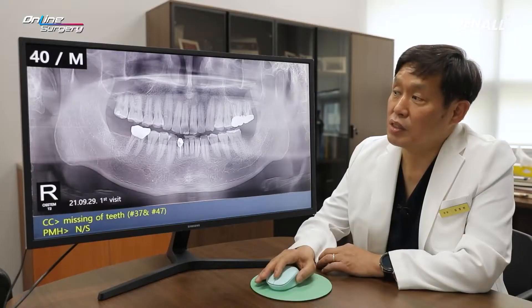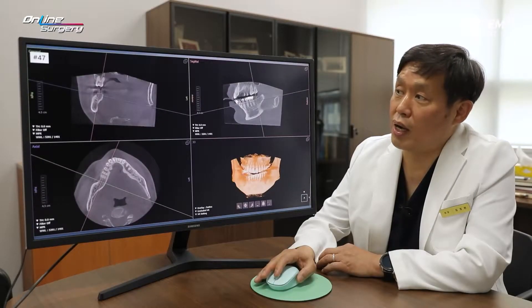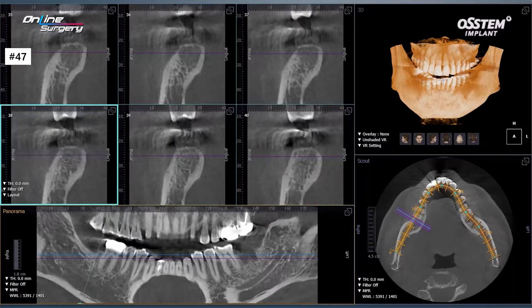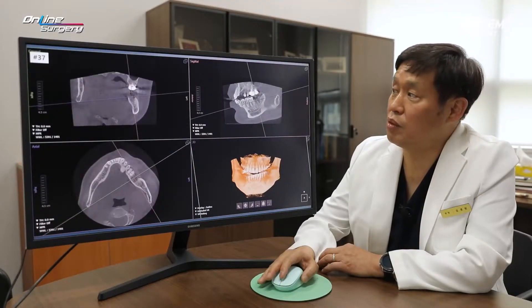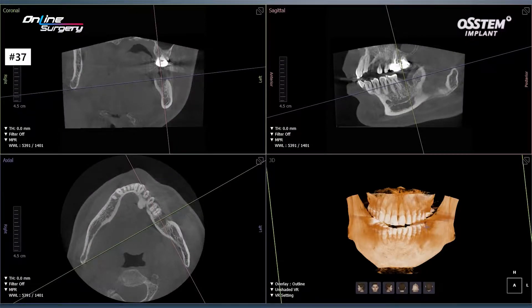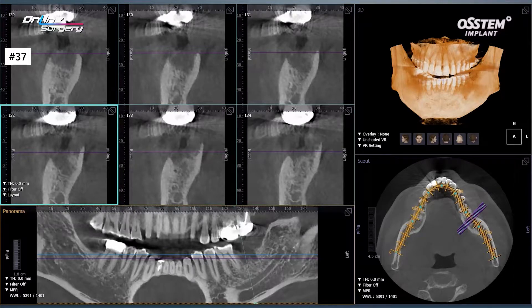At the initial visit, CT was taken for number 47. Healing has occurred somewhat on CT — it looks almost six months since extraction, and there's no major problem in placing an implant here. As for number 37, the extraction socket is not fully healed. Looking at the CT, on the lingual side the cortical bone is slightly high, and the buccal side is a bit resorbed.